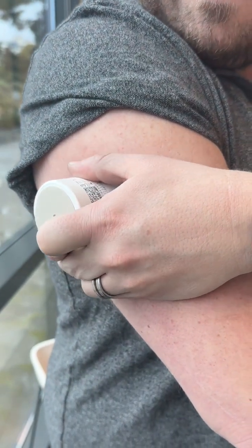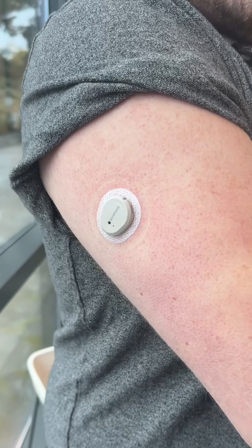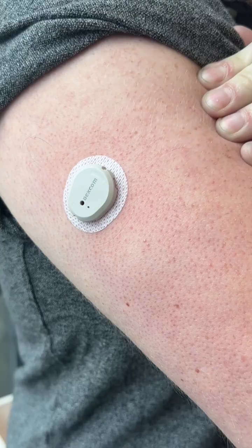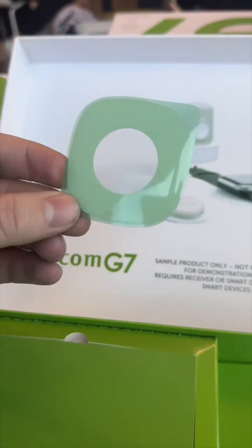This does connect to your iPhone over Bluetooth, but with a future update, this will be able to connect directly to your Apple Watch, so you don't need your iPhone at all. Plus, they're going to extend the wear time to up to 15 days.